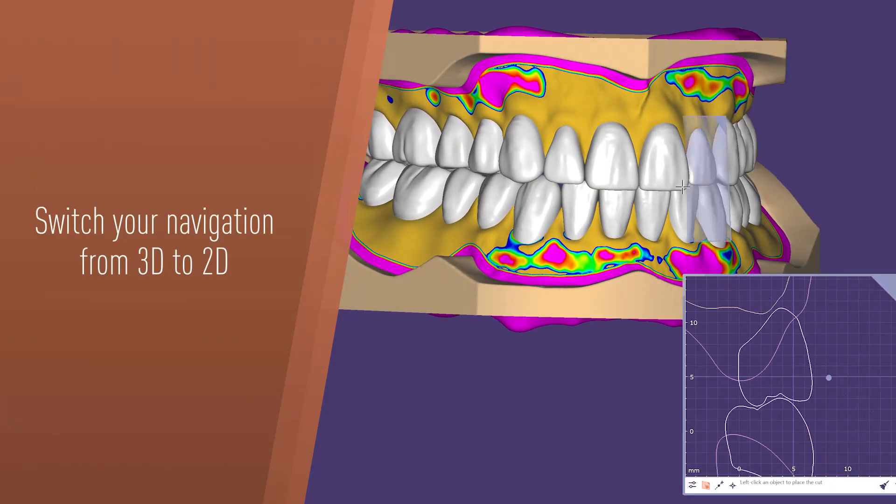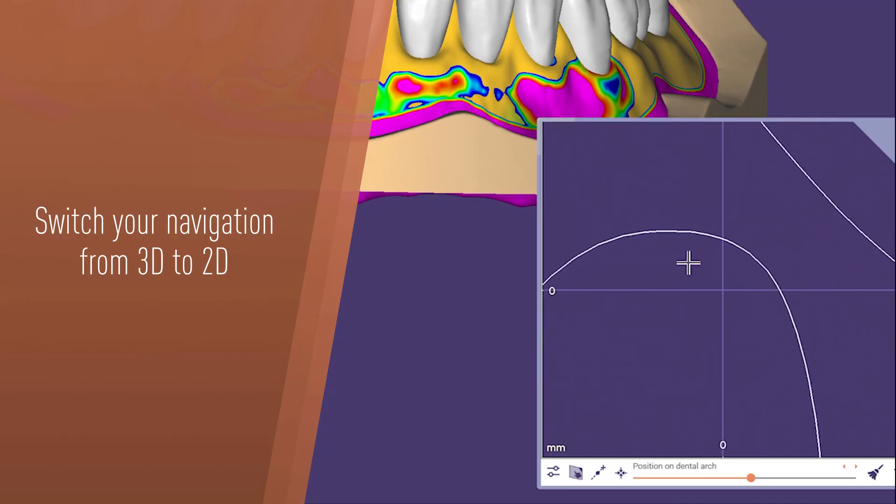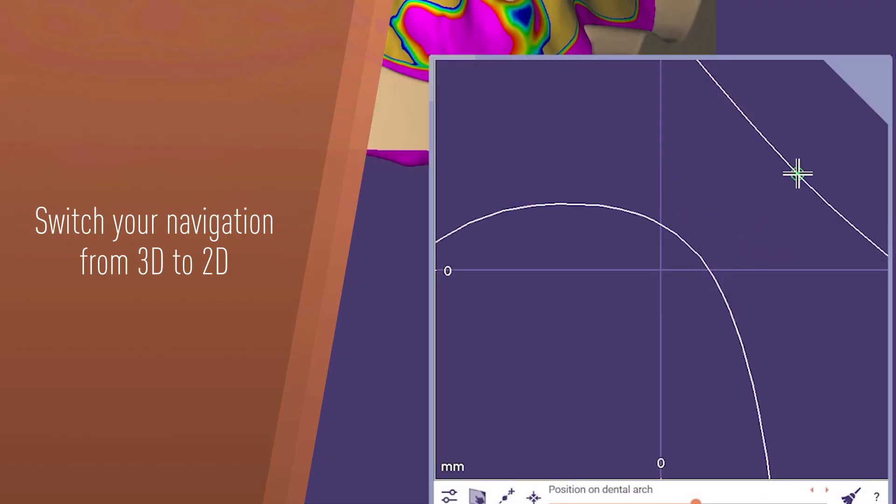Switch from 3D to 2D navigation for detailed cross-sectional analysis, allowing accurate assessment of jaw anatomy and tooth positioning.